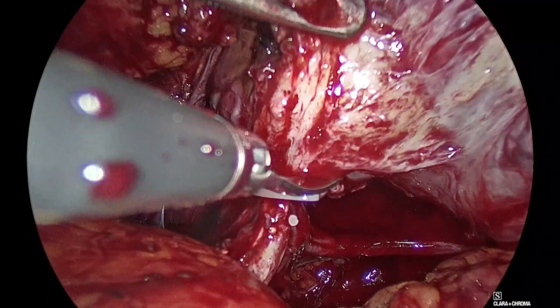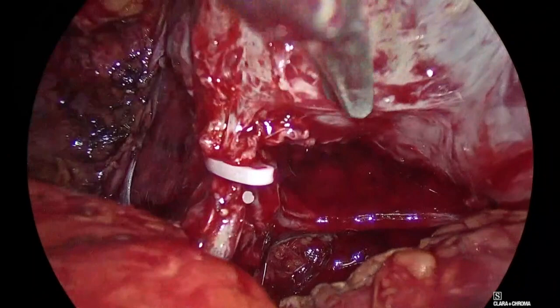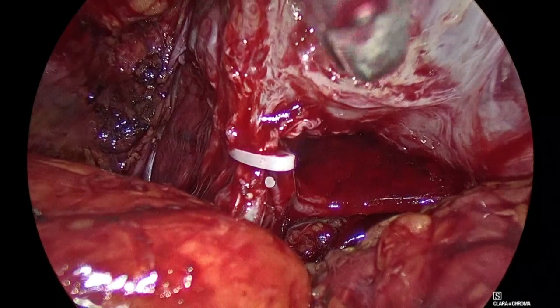Good. So the capsule is here. You can see the capsule. Here is a bit intracapsular. Can you see this, guys? Yeah. So here we're on the right spot.